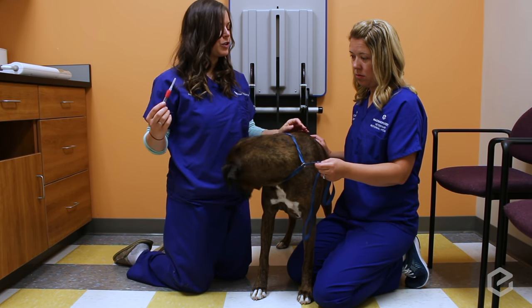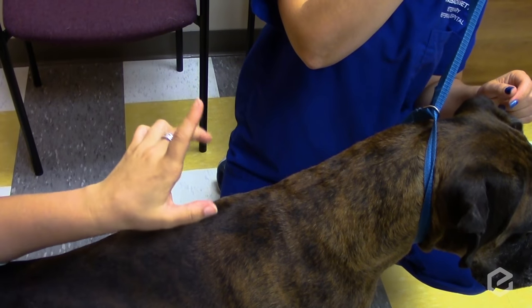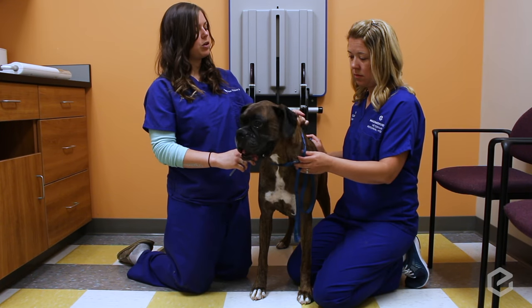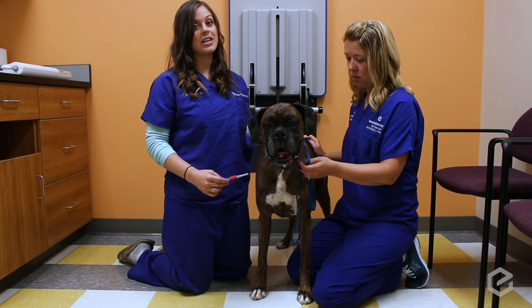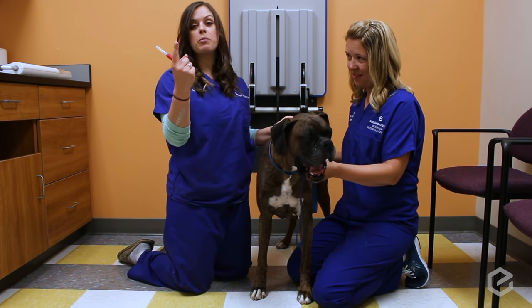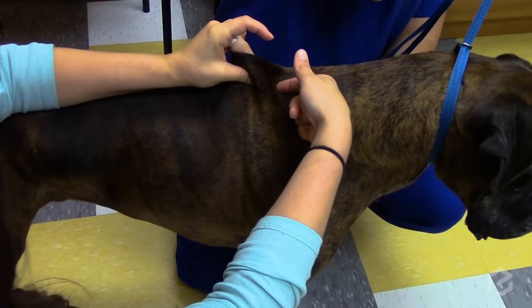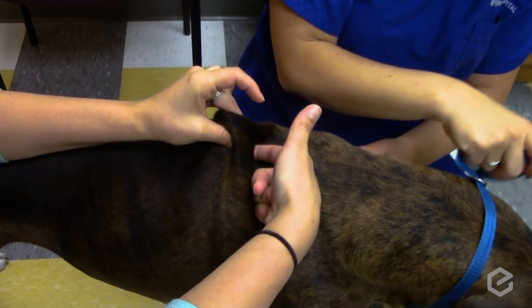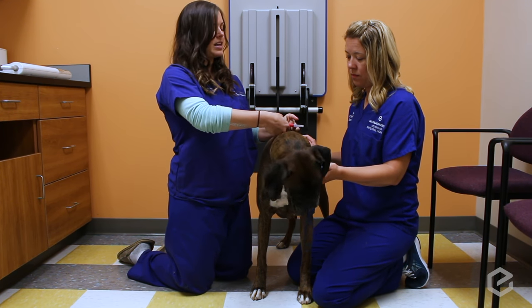To pinch, use your middle finger and thumb, grab their skin, and pull up. This doesn't hurt them and they usually don't notice. Then take your pointer finger of your other hand and poke right between your two fingers to form a little pocket — you'll be able to feel that really nicely. That's where you're going to put the injection, right in that pocket.